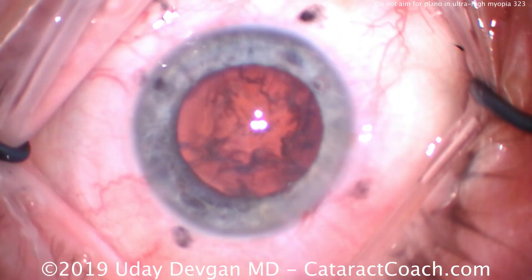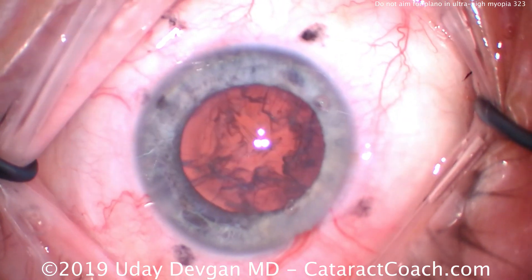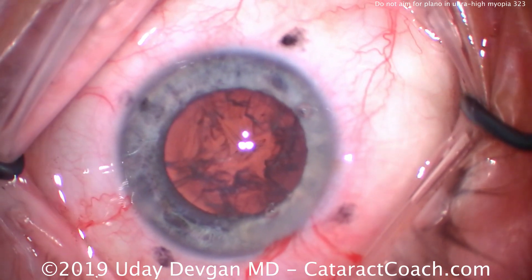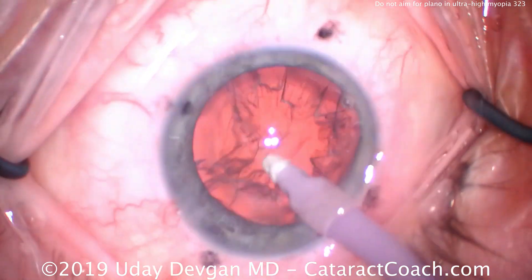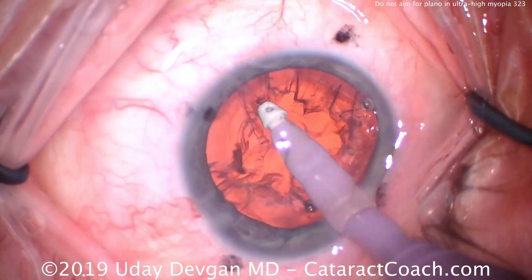As covered in previous videos, reverse pupillary block happens commonly in these ultramyopic eyes. Be cognizant of that. If you do get reverse pupillary block, remember just to tent up the iris to equilibrate the pressure between the anterior chamber and posterior chamber.